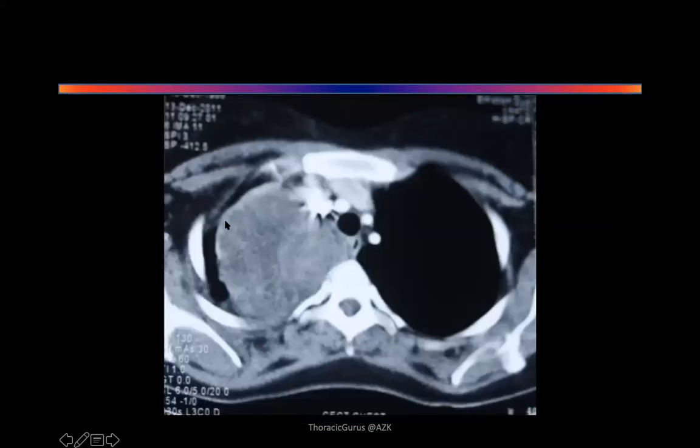Okay, now let me quickly go into this and show me what this is. Describe this to me. Neurogenic. Same tumor. Describe this to me. This is only the mediastinum. Only the tumor. Well-defined, circumscribed, isodense tumor abutting the vertebra and abutting the superior vena cava. Okay, good. And there is a device in the superior vena cava. Maybe, yeah, you're right. There is a device actually in the SVC. Correct. Well done. Give me differential diagnosis quickly.